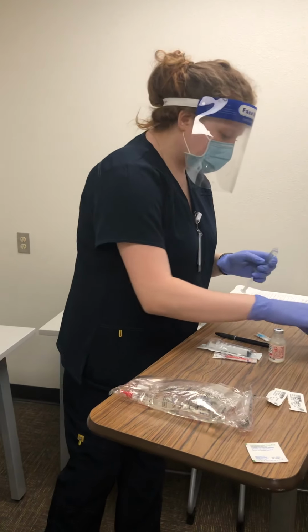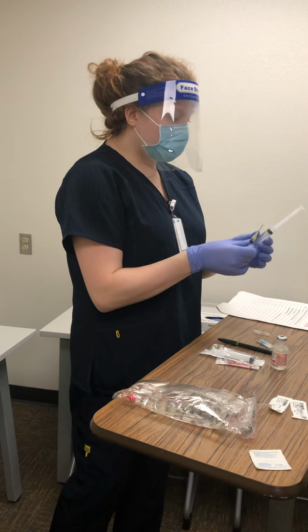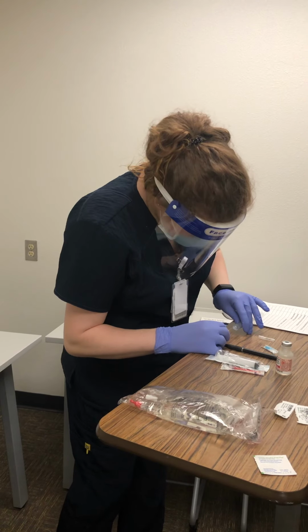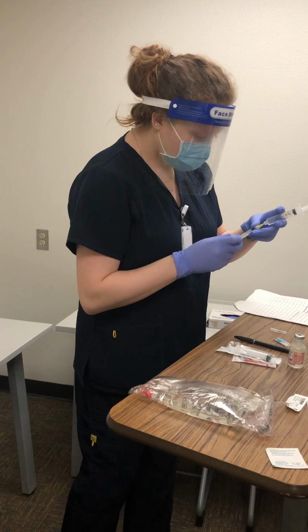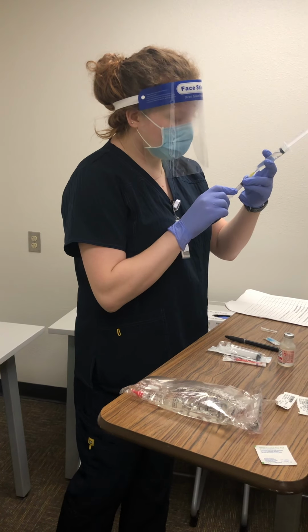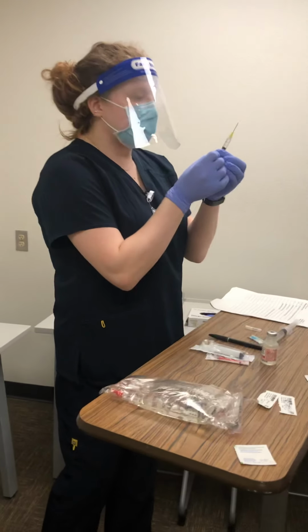Okay. Let's see, and the total volume inside my syringe will be 1.4. And I did not touch that with my glove. I need to not to. Okay. And that is at 1.4.